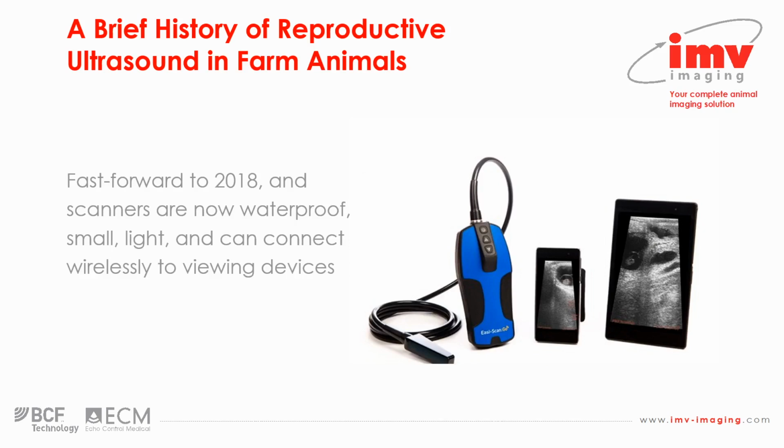If we fast forward to 2018, BCF, now IMV Imaging, released the EasyScan Go, which is a waterproof, wireless, ultralight, portable on-farm scanner which transmits live ultrasound images to a Wi-Fi enabled device such as a tablet or phone.